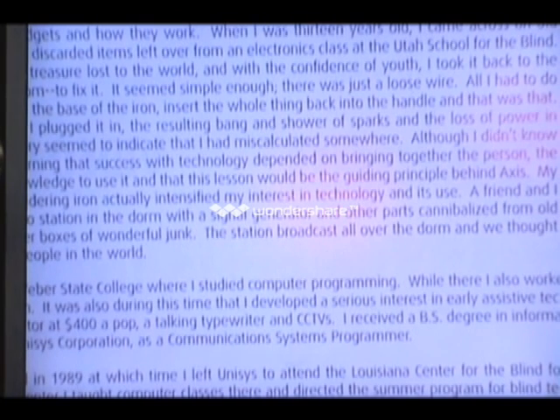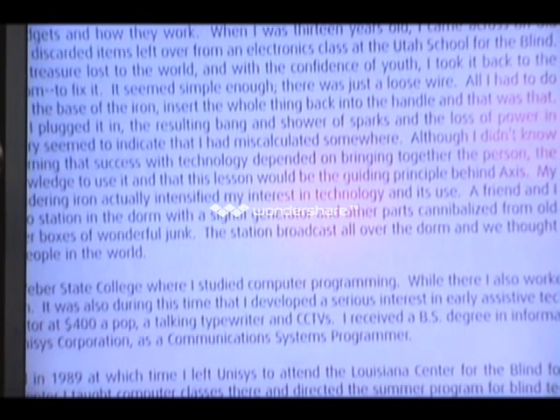What's funny is I don't know why they chose red, because red seems to me to be the most common color that people with macular degeneration can't see. So I have a lot of customers who can't see that even if you do turn it on. But if you can, it's very helpful to put that red dot right down there on the check where the line is to be signed and the place to write Carl Smith is.